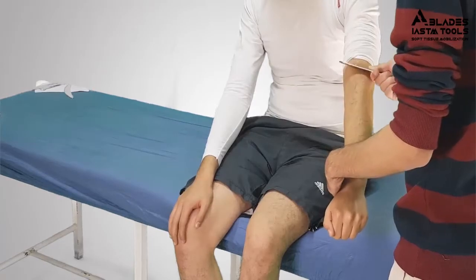And most importantly, for the safety and protection of patients, we will talk about indications, precautions, contraindications, and what are the well-known conditions that IASTM is very efficient and have good results on. And finally, apply the techniques for the upper body and lower body.